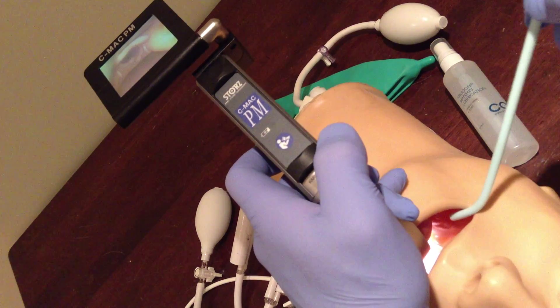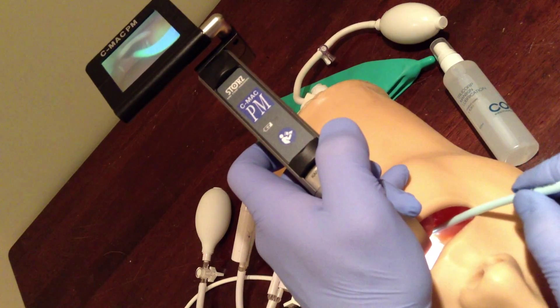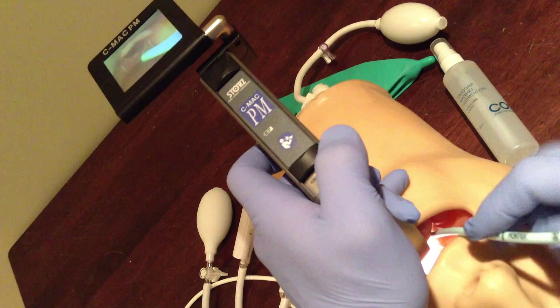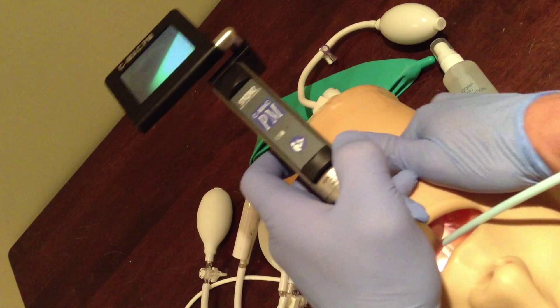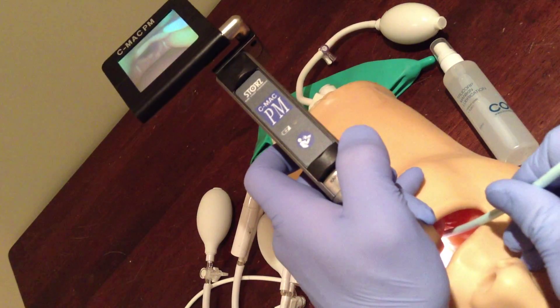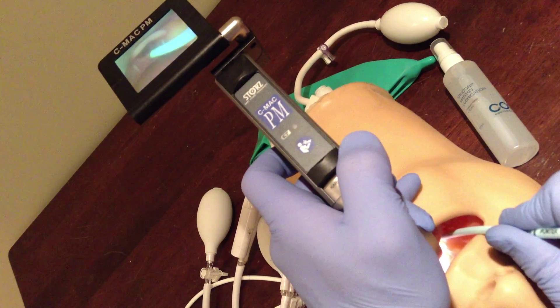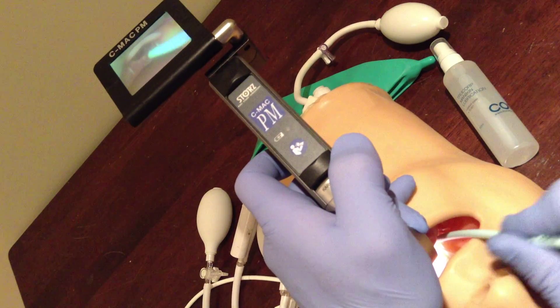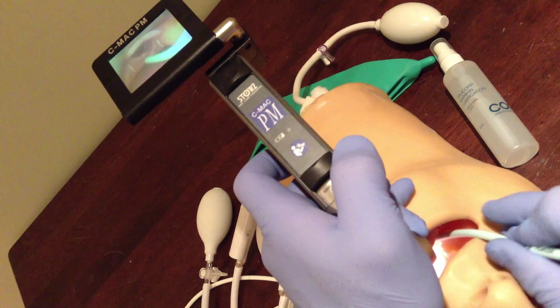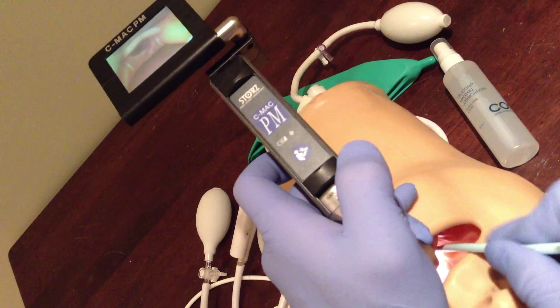I could try a right paraglossal approach. It's a much more shallow angle, and you can see how I can almost make it with this. Maybe with a bit of external laryngeal manipulation, downward pressure might be able to get it. But this right paraglossal approach — I can just barely almost make it, but just cannot quite get there.